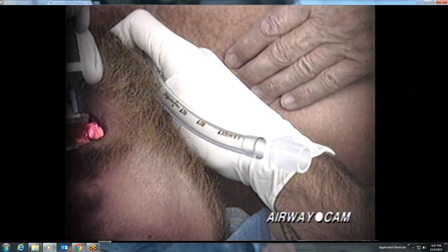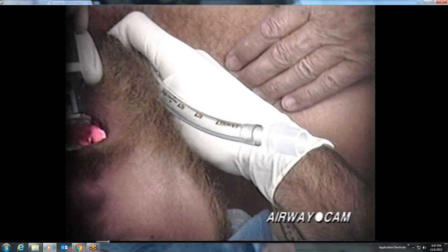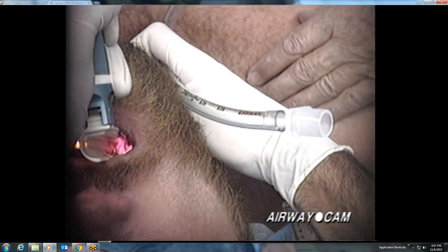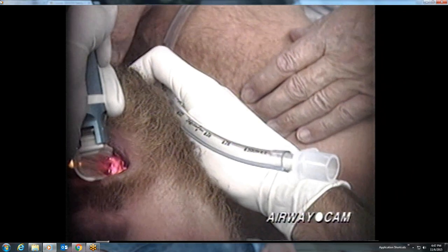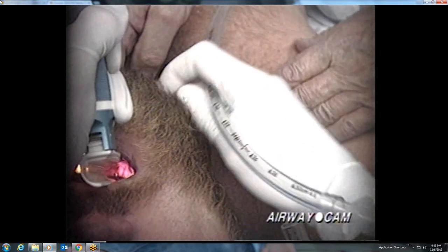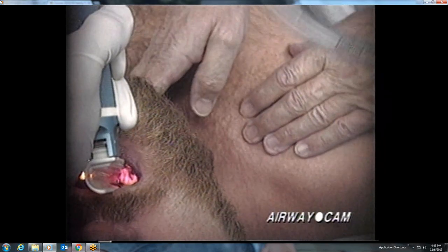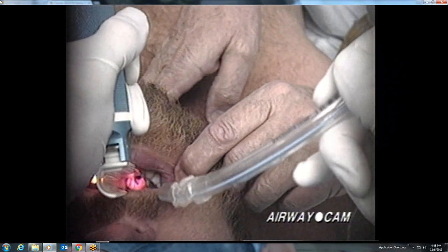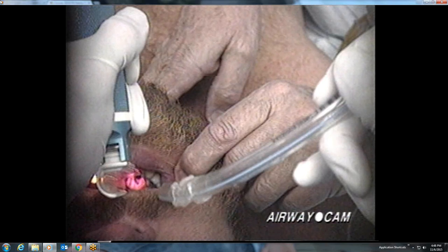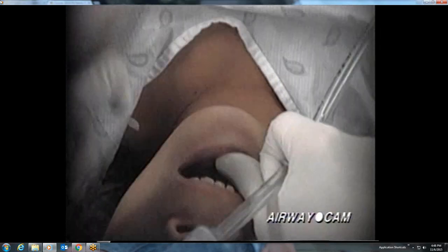While pressure on the cricoid cartilage by an assistant is often used to prevent passive regurgitation of stomach contents, pressure on the thyroid cartilage aids landmark recognition and visualization. The vocal cords are attached anteriorly to the thyroid cartilage. Manipulation, especially posterior displacement of this easily palpable structure, improves alignment of the larynx with the line of sight. An assistant is then used to continue pressure on the thyroid cartilage, freeing the laryngoscopist's right hand to place the endotracheal tube.